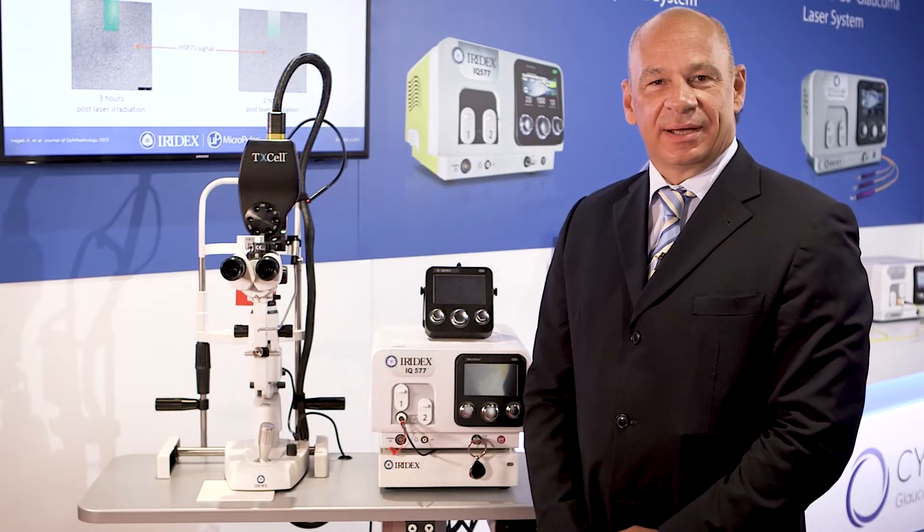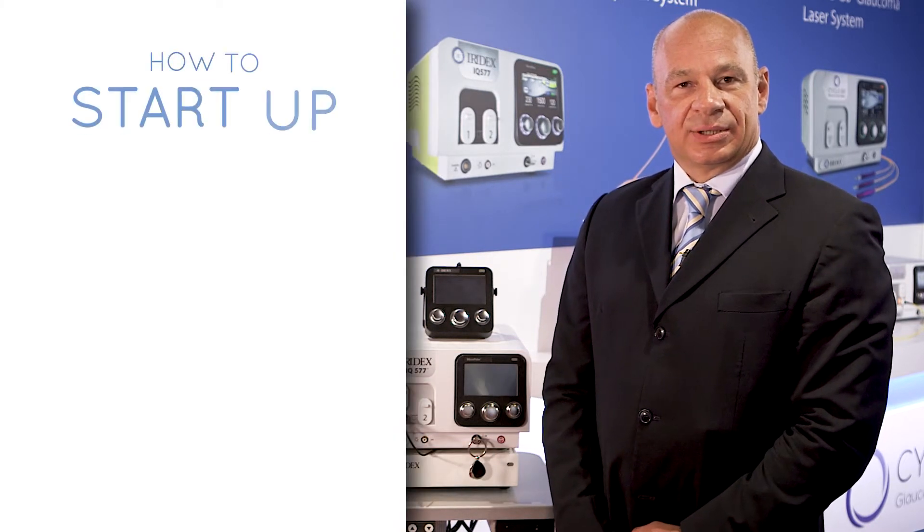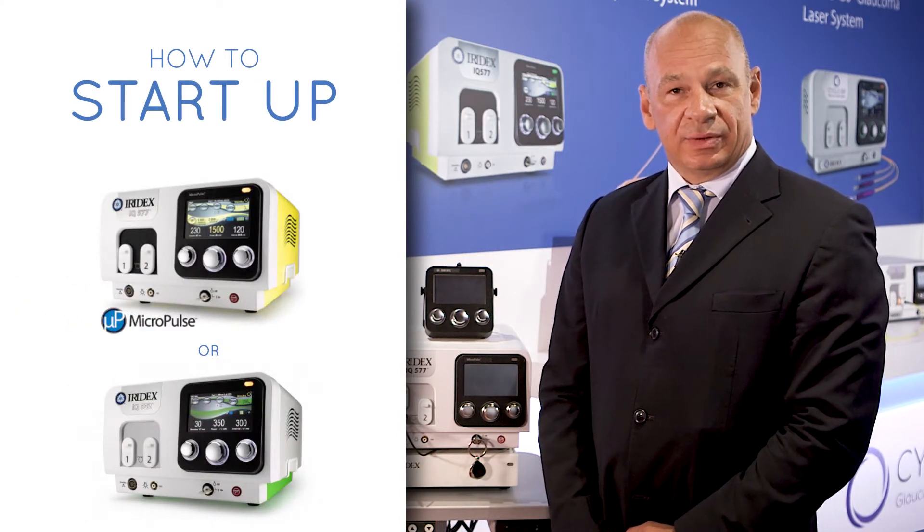Hello, my name is Franz Weingartner. I'm the International Area Sales Manager for Iridex Corporation and I would like to explain how to correctly start up either the IQ 577 or the IQ 532.